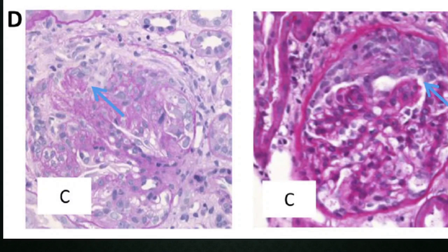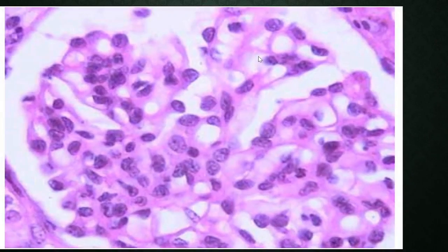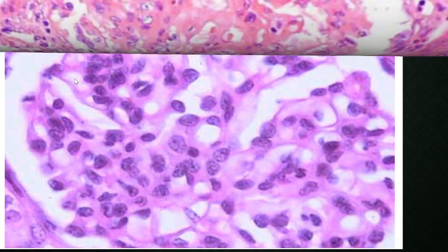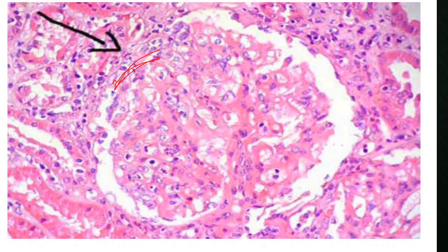To illustrate crescents: this shows proliferation of parietal epithelial cells more than two layers thick — indicating presence of a crescent. Another image shows increased mesangial cells — more than four mesangial cells as per the definition in the MEST-C score. A further image demonstrates crescents along with endocapillary proliferation and mesangial hypercellularity together.